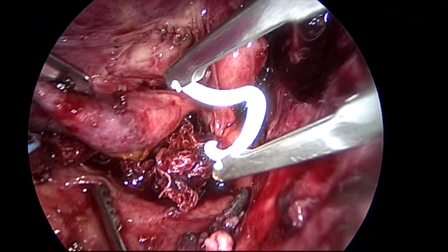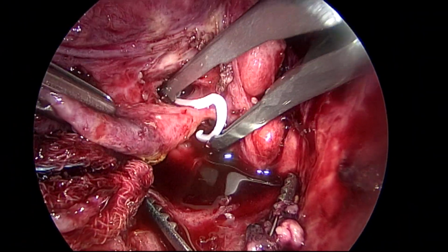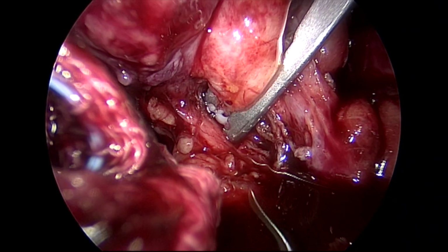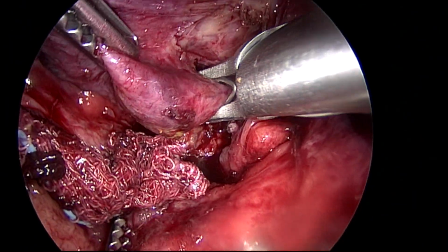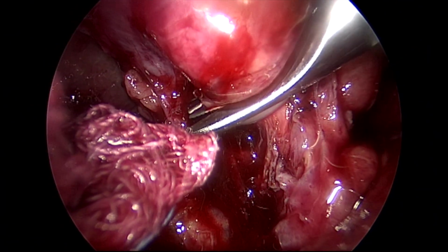I could find the cystic duct. You can see the cystic duct is delineated. I am applying a Hem-o-lok clip now. So I could identify the cystic duct CBD junction, and I am able to put a clip. The type 2 subtotal cholecystectomy is very rare in my unit because of these steps.